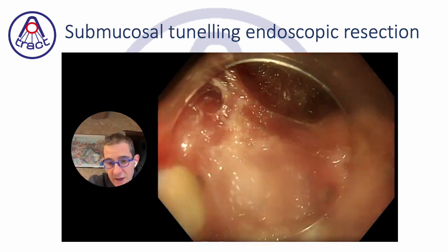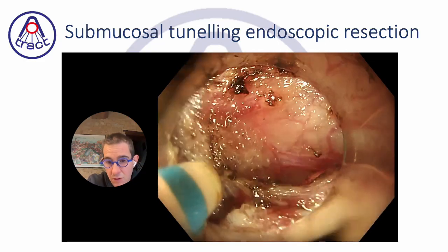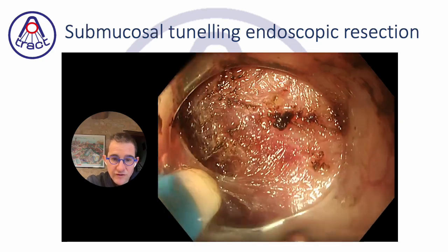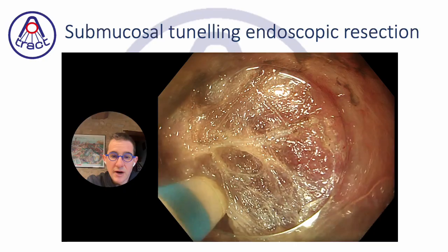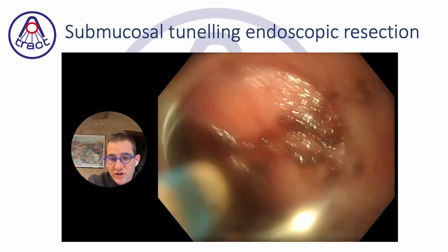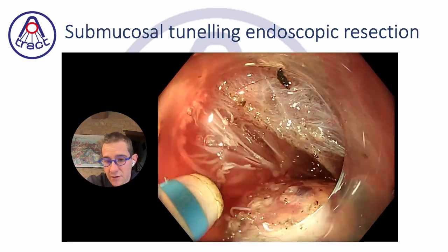In this part of the procedure, clearly, I prefer to have a non-exposed procedure into a tunnel. I know that there are a lot of strategies doing a complete perforation with a pneumoperitoneum without a lot of consequences for the patient, but nevertheless, we are not surgeons in France for doing this kind of procedure, which is the task of the endoscopists who are gastroenterologists in France. And therefore, we are more confident when the pneumoperitoneum is less important and when the area of muscle damage will be covered thanks to the mucosa that has been protected during the procedure. And really, our strategy, when it is feasible, when the tunnel axis is quite easy to do, the first option is clearly the tunneling strategy.